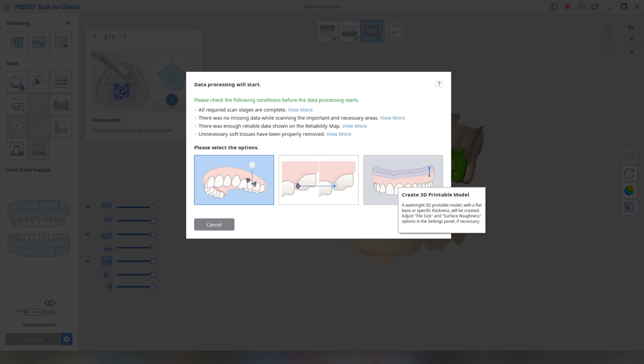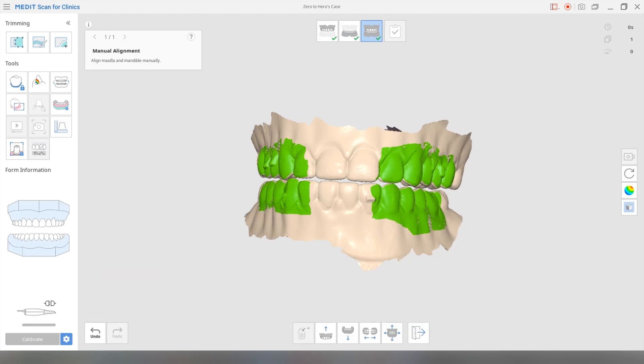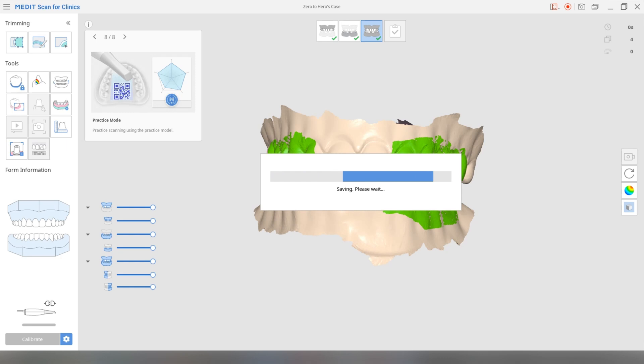I don't really choose this option. And then three, create 3D printable model. Well, we'll show that in the model designer app later. But yeah, usually you will stick for this first option. And that's basically it.